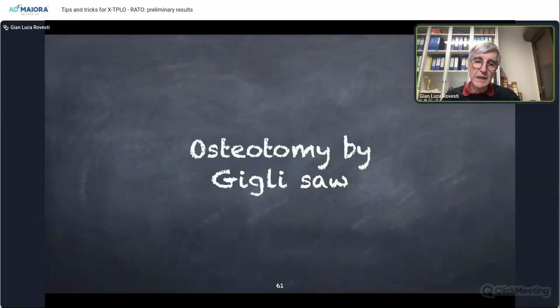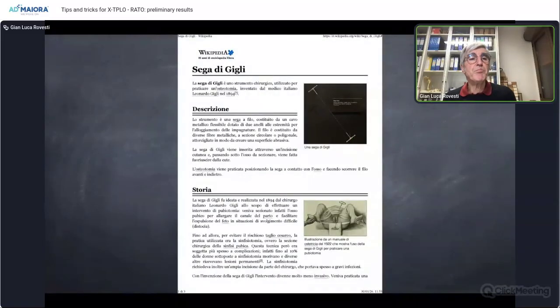Gigli was a surgeon, Italian. In Italian it is pronounced differently, but let's say we are talking in English. And he was not an orthopedic surgeon. He was a gynecologic surgeon. And the Gigli saw was developed to cut the pubis during parturition, difficult parturition, okay? So nothing to do with our objective. This is how the Gigli was presented and used.